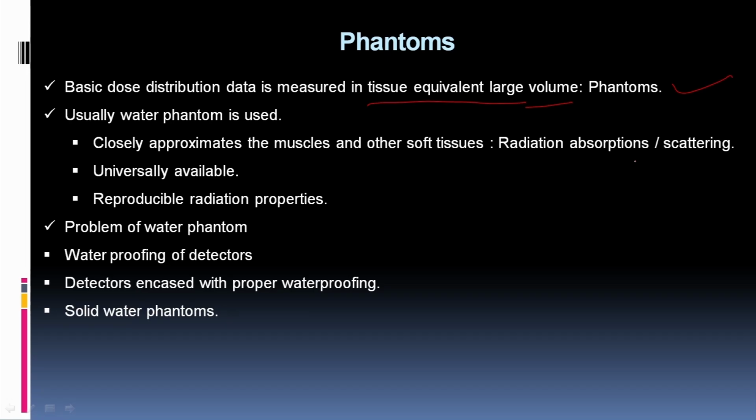We encase the detectors with proper waterproofing, or we can change our water to a similar kind of solid material. They are known as solid water phantoms.